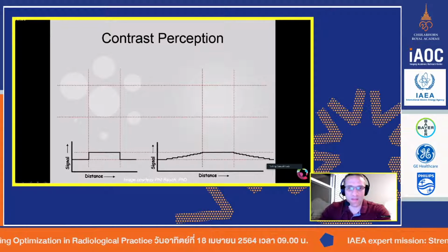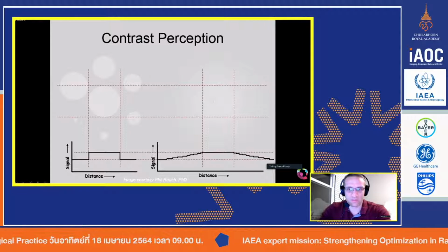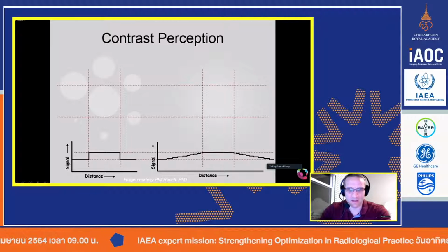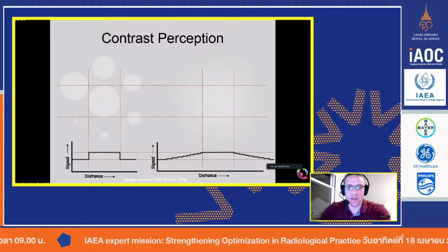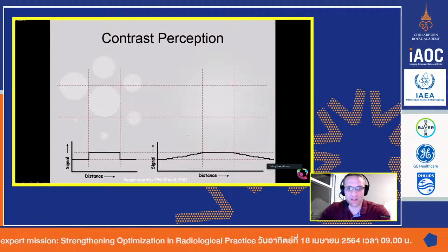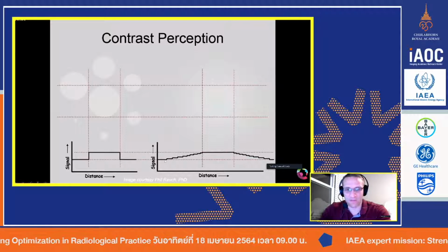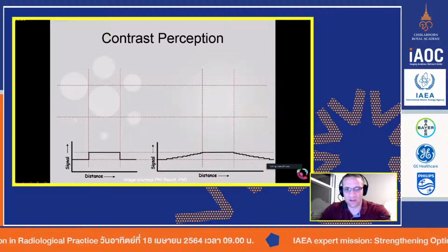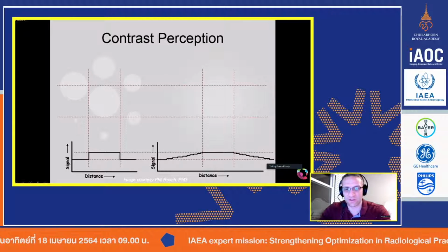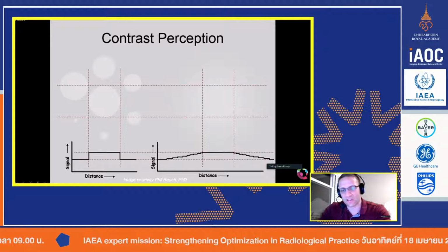Now, this same circle is right here. I promise it's there. But look at my plots down here. The difference is there is a distinct edge on this object, whereas on this one there is a gradient. I have slowly changed the grayscale value from background to the value of this circle, and I have made it very gradual so that there really is no edge.